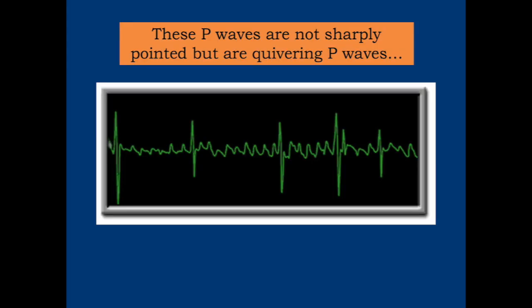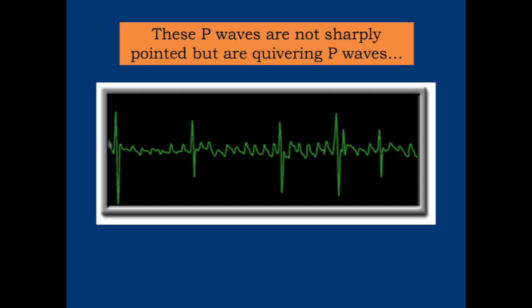This is going to be atrial fibrillation. We've got quivering atria, both left and right, and the EKG still hooked up in its normal positions with white to the right and smoke above fire. So if you will, we've got quivering, just fibrillating atria. So no blood is being pumped. We talked about no atrial quick kick, giving us that extra 25% of blood. So we've got real problems for the patients here.